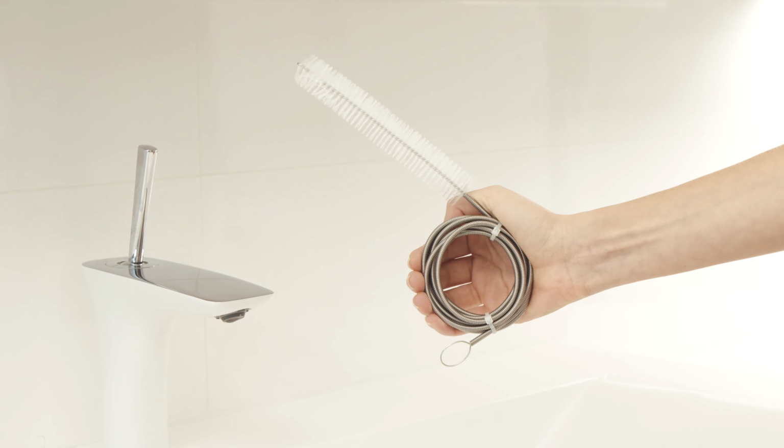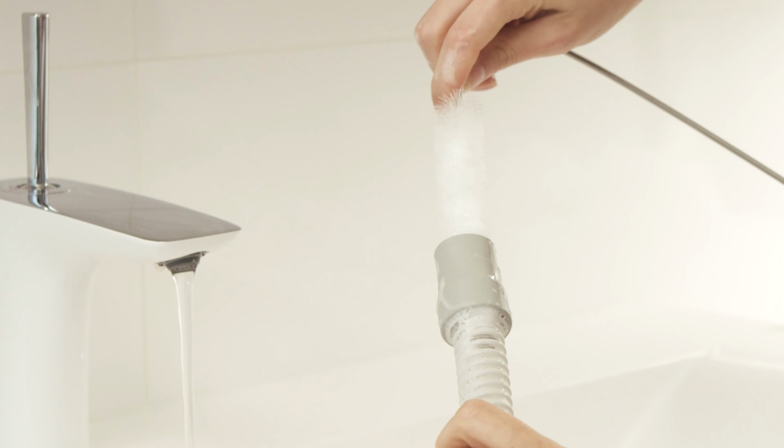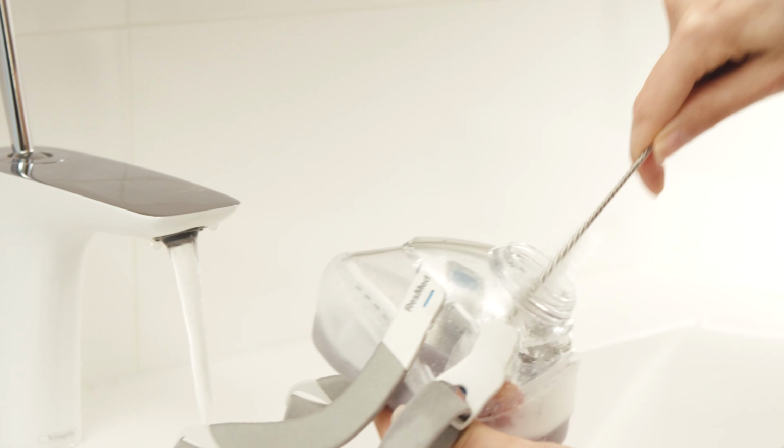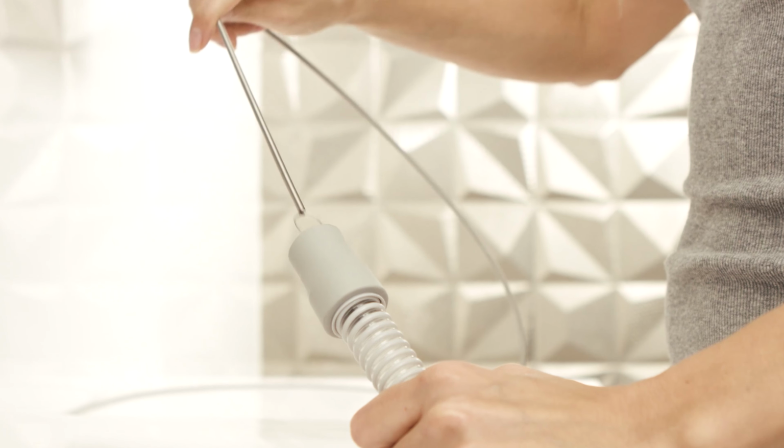Snuggle also offers a tube cleaning brush set. If you want to get deep down into the tubing and get it nice and clean on the inside, you can rinse it off with that clean water as well.